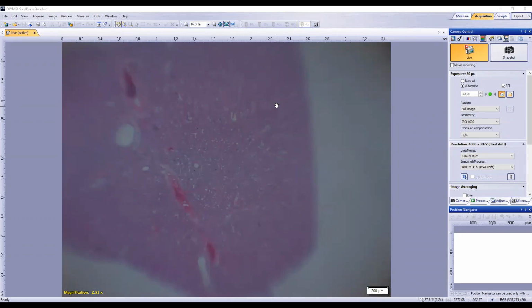Because there's so much edema, cattle seem to be particularly good at trying to mop that up too. So the interlobular septa end up getting very wide, and there'll be this strange space, not quite clear, but not quite dense amorphous material, and you can see distended lymphatics in there that are full of fibrin and things like that. And we don't have that going on here.